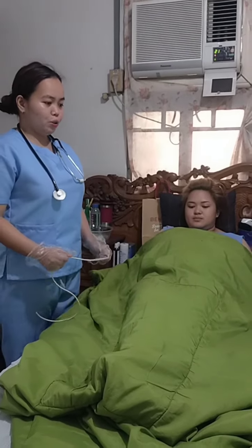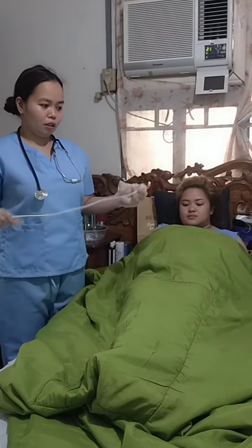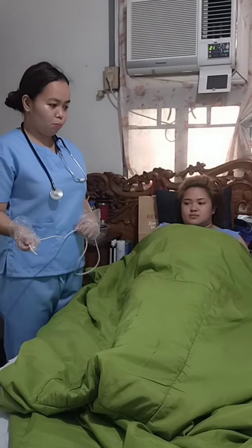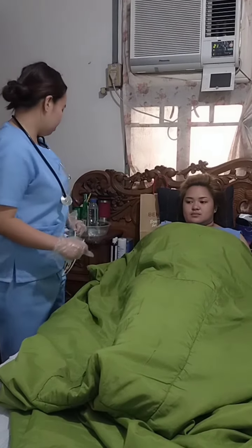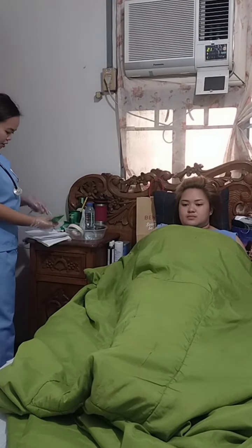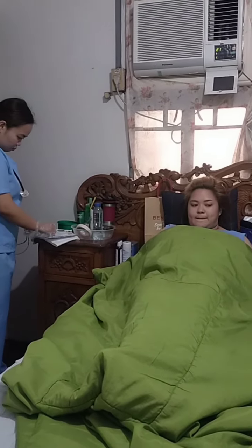Measure and ensure that the tube is long enough to reach the client's stomach. Then lubricate the tip of the tube at least 1.5 inches using a water-soluble lubricant. This reduces friction and facilitates the passage of the tube to the stomach. So using the lubricant, we're going to put lubricant on the tip of the tube.